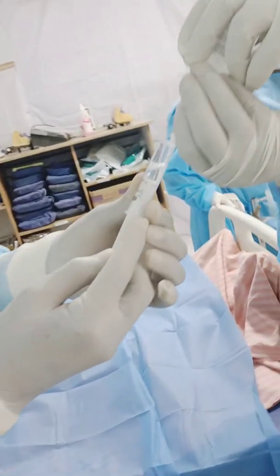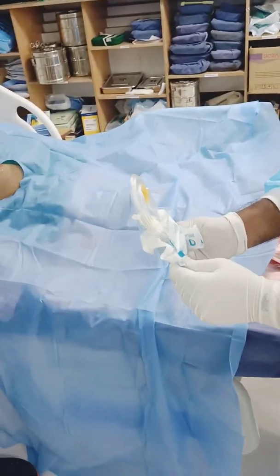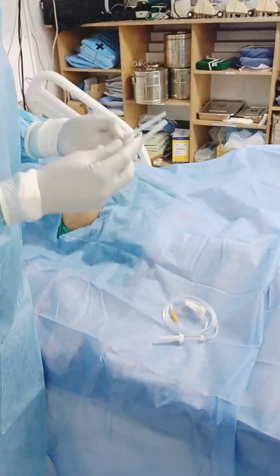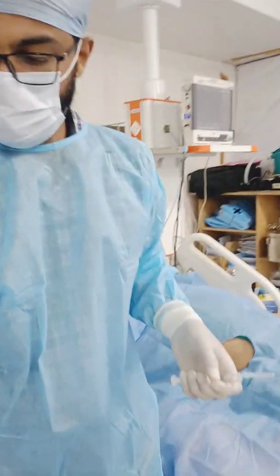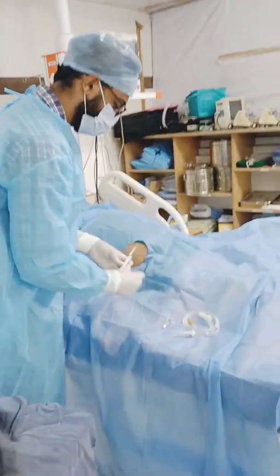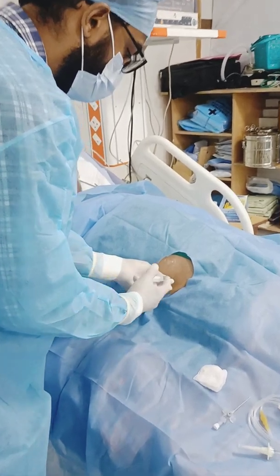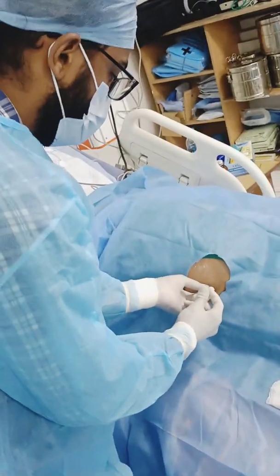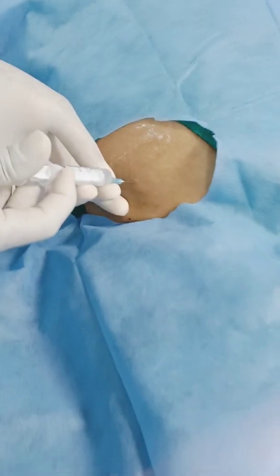Loading local anesthetic lignocaine. There is a 16-gauge needle. Anesthetize the skin with lignocaine. I have already taken informed consent from the patient and the relatives about this procedure.